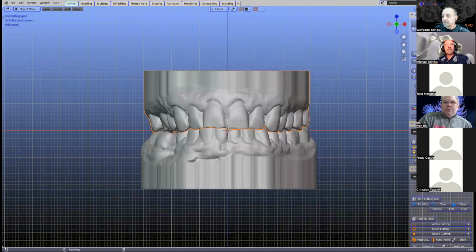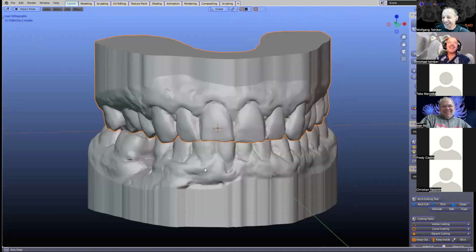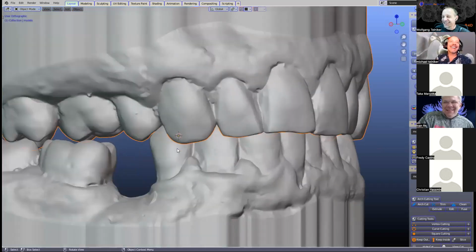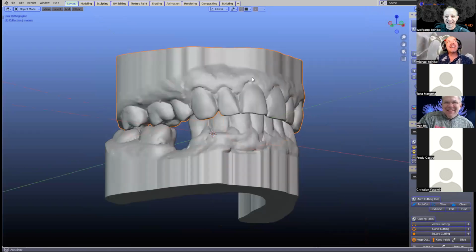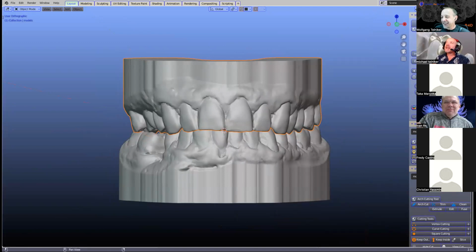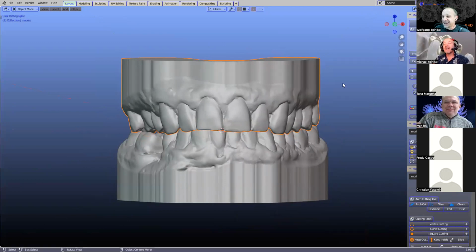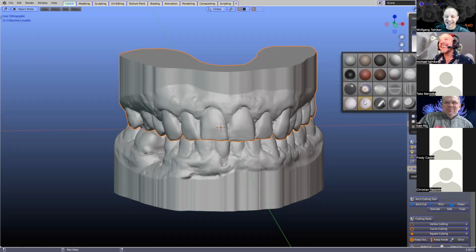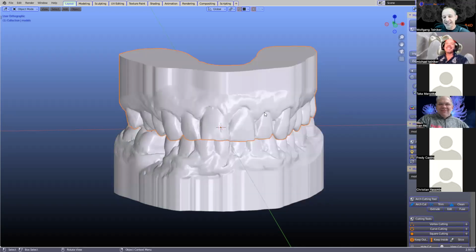Okay, so Wolf, I believe this is your jaw. That's good. You've got a tooth missing, by the way. Where's the privacy, Michael? The patient privacy. You have to get consent before the Zoom session, by the way. Didn't you tell me to have a Zoom session with your models? No, I said we're doing a snore guide, but this is a bit of a surprise. Don't lie. Please don't criticize my teeth.